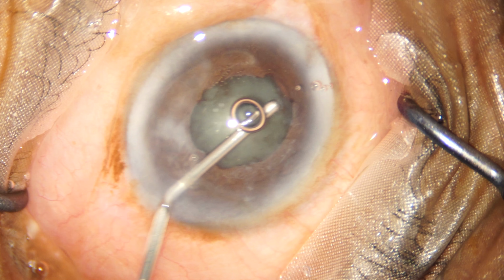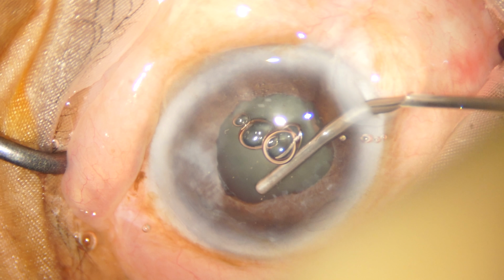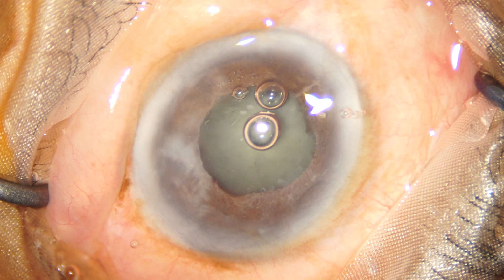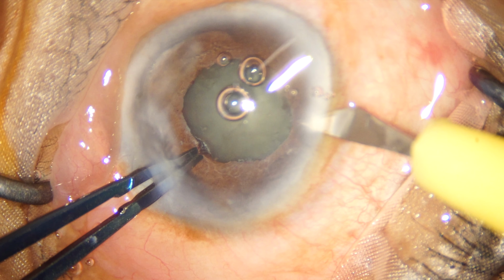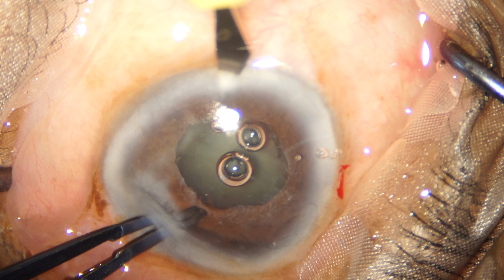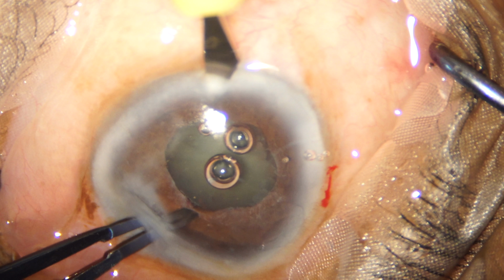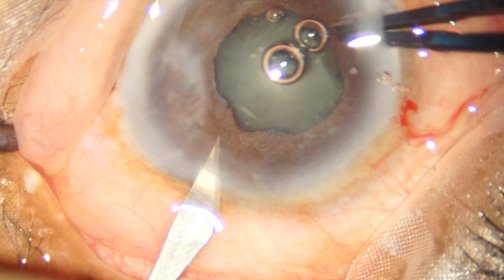So I augment this dilatation with some viscoelastic substance, and I am not satisfied with the amount of dilatation that I have, so I decide to go in with the iris hooks placement. You'll notice that I'm making four side port incisions in a posterior limbal location, and I'm not making a complete entry with my side port knife, only a partial entry, roughly 0.75 to 0.8 millimeters.